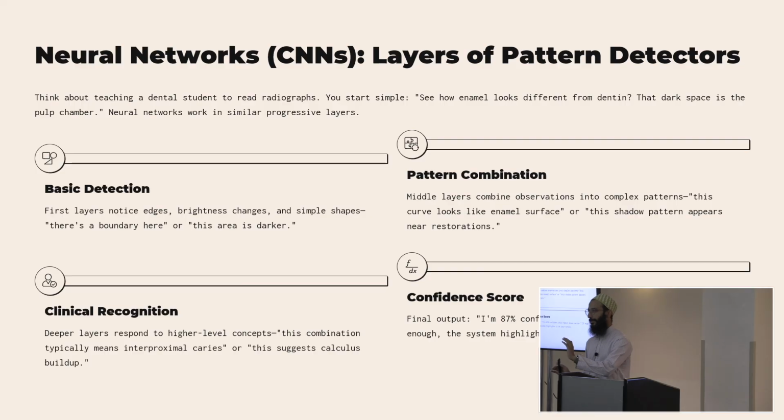And so when you go to start training a model, the model starts out very dumb, very dumb. First, you basically have to train it to recognize that this pixel is light and this pixel is dark. Then once it gets past that step, it learns that there are a couple of light pixels here in a curve.